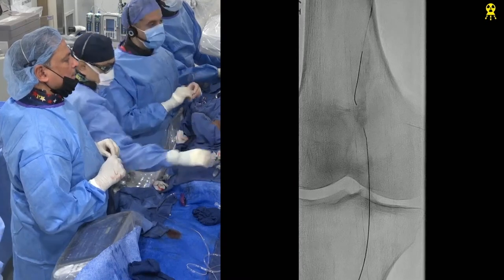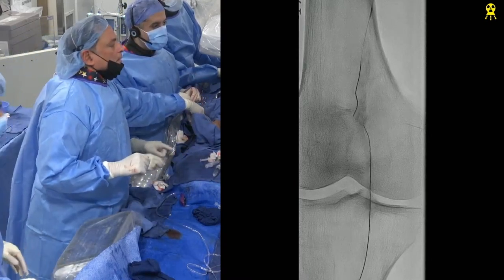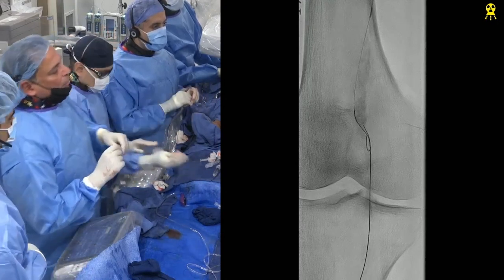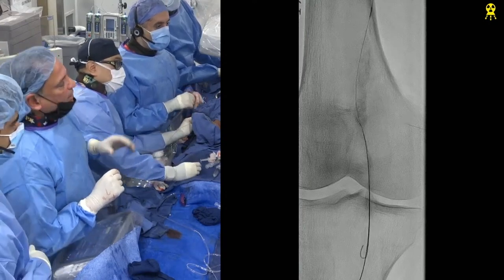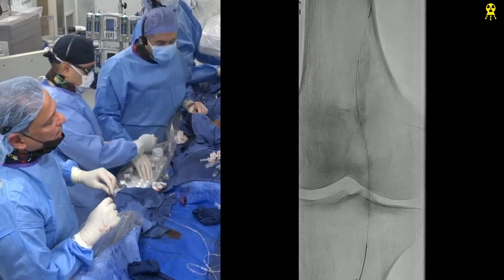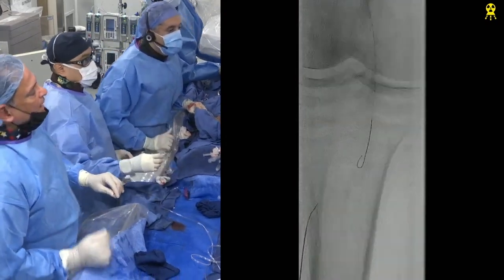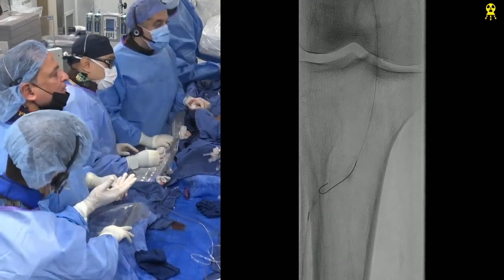So is the plan now your 035 Navi cross from below? Yeah, well, we're just going to now see whether you can, Ray, push my catheter up. I think it seems above, like it's looking in, better. It's in, right? So, hold it there. Get into the catheter. One second. Can I see down? You got to put in the catheter, Vishal. You crossed the catheter, dude. Okay, what are you doing?